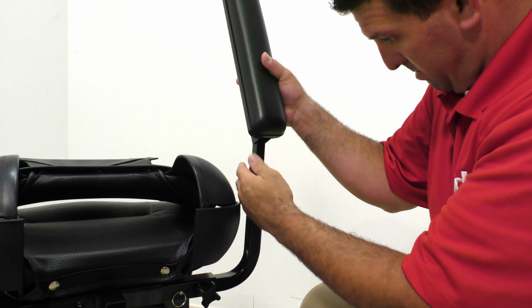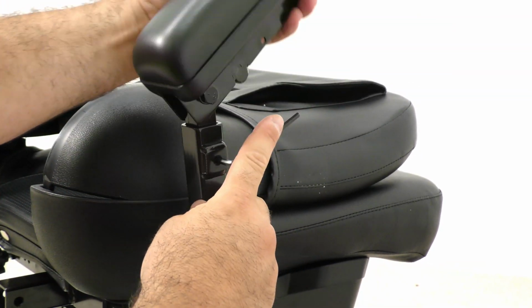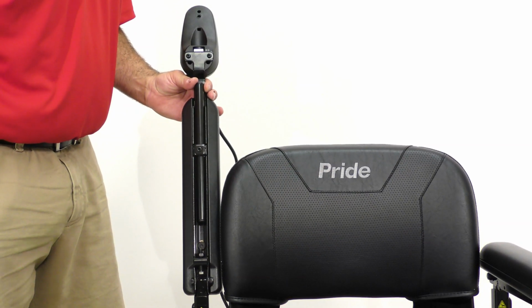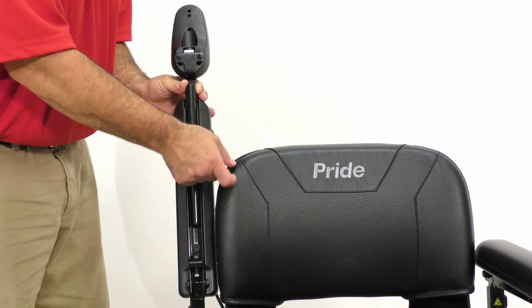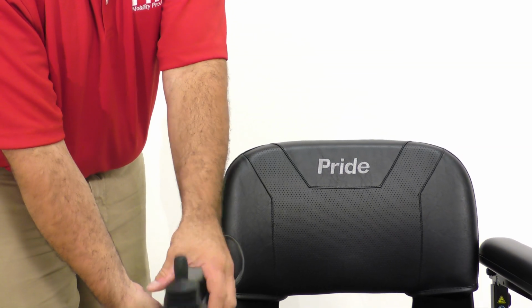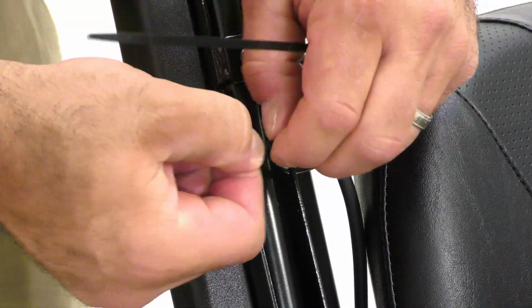Place the upper half of the armrest in the lower half and tighten the set screw once the desired height is reached, and repeat on the other side. The armrests are universal for mounting the joystick, so once you determine the joystick side, slide the joystick mount in the armrest and tighten the set screw with the 4mm Allen wrench. Use the wire ties to secure the harness to the hole under the arms.